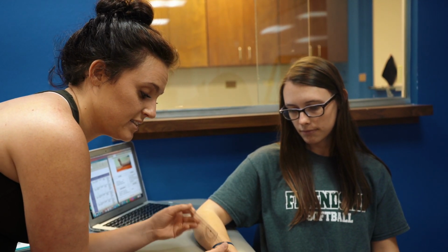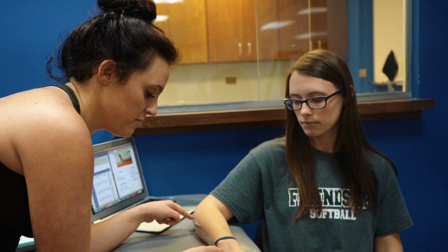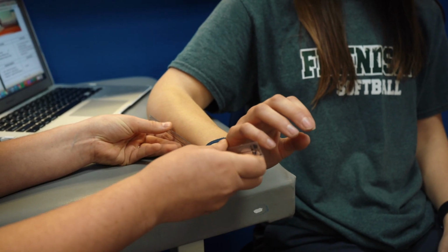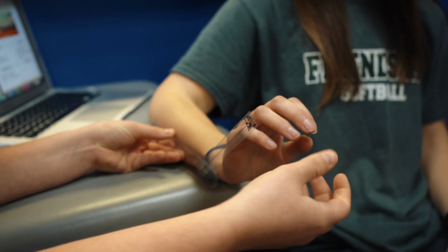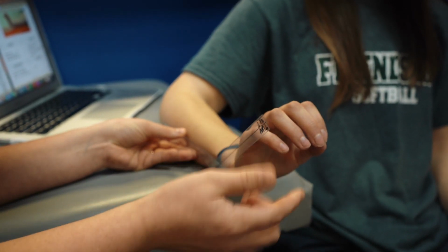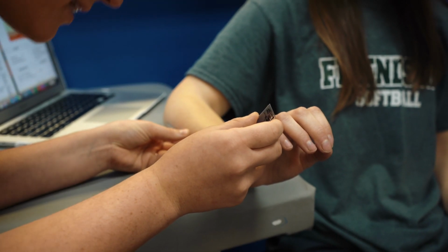Okay, so we are going to do wrist extension. We want to make sure that it's sunny side down, so the half circle is pointing down. We're going to line up the stationary arm with her forearm, and then the moving arm, we're going to have her go ahead and extend. Fingers aren't flexed. Fingers are nice and loose, so we don't want them flexed. And we're going to put the moving arm up to her pinky side. So she is at about 60.